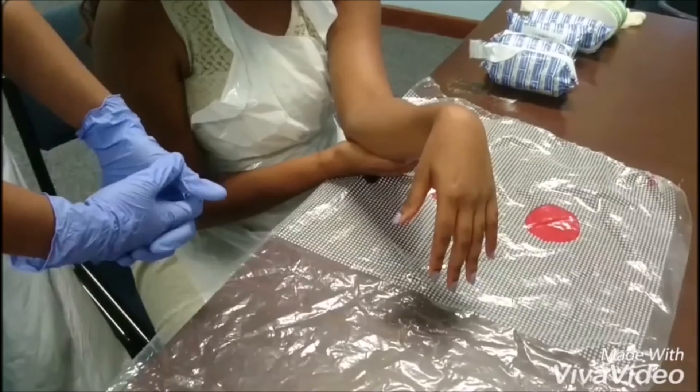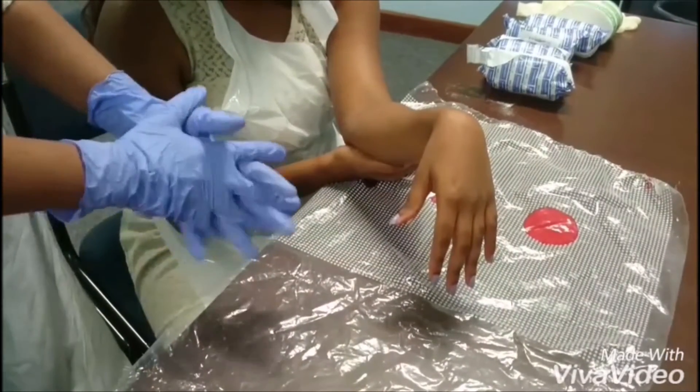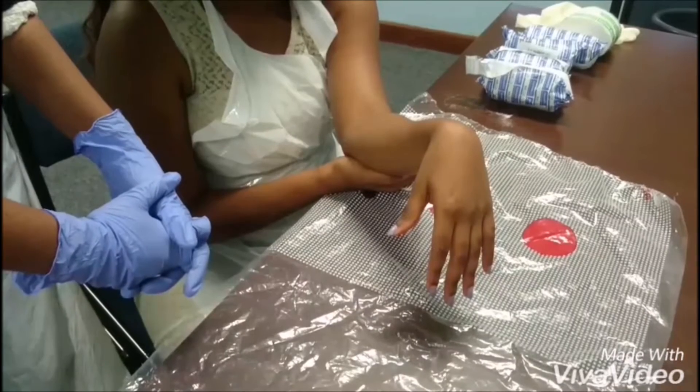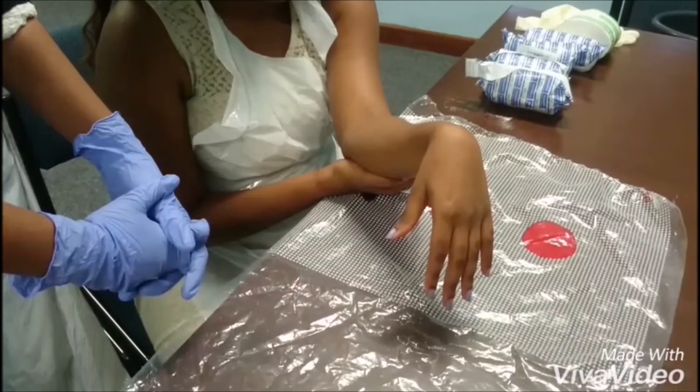Before we begin the procedure, the doctor needs to wash their hands, put on an apron and gloves. In this video, the doctor has already done so. Expose the patient and remove any jewelry. In this video, the patient is fully exposed and has no jewelry on.